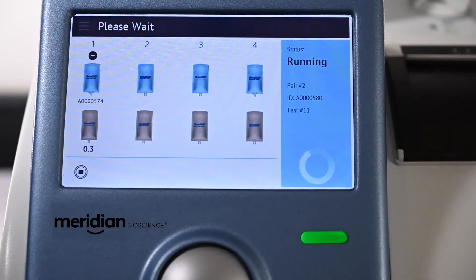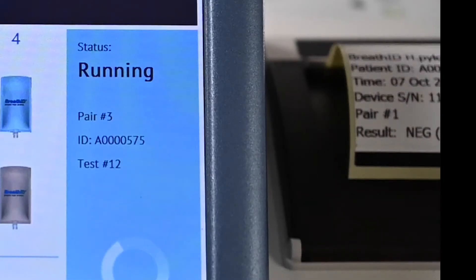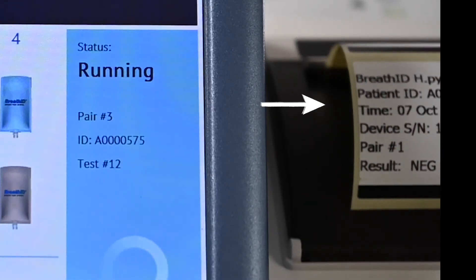This same process will repeat for each pair in the batch, meaning a full run takes approximately eight minutes. Test results will appear on the screen as each specimen pair is completed. The instrument will highlight a blue icon above the finished pair displaying the result. Both the delta over baseline value and the positive/negative result will be displayed. A barcode label with the result will automatically be printed following completion of each pair.